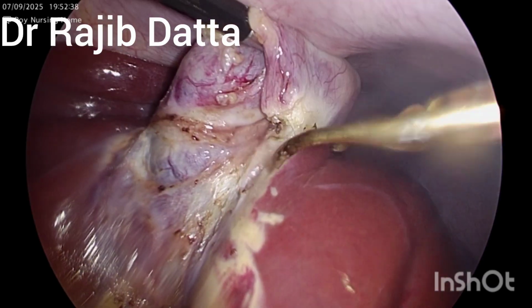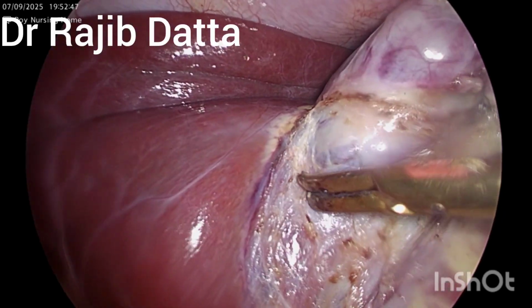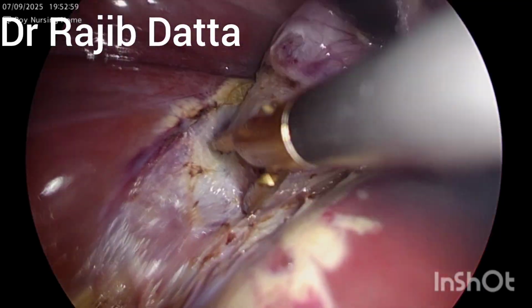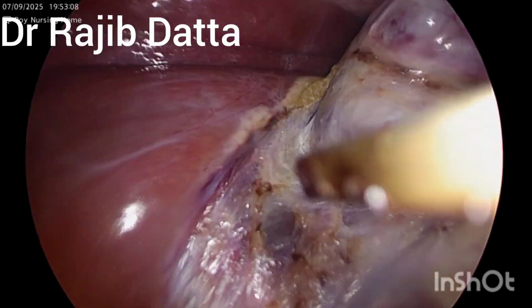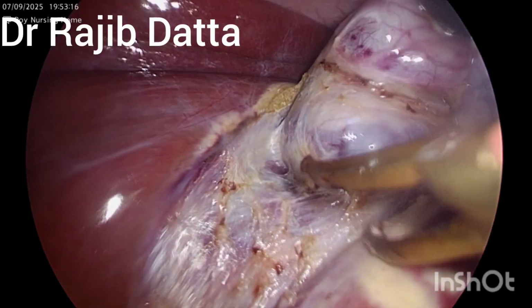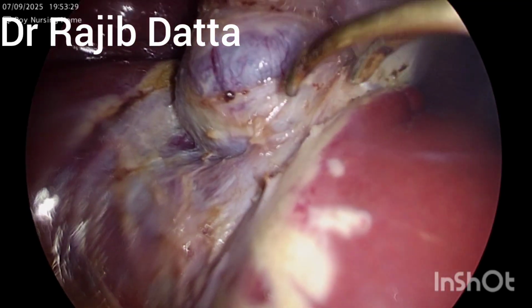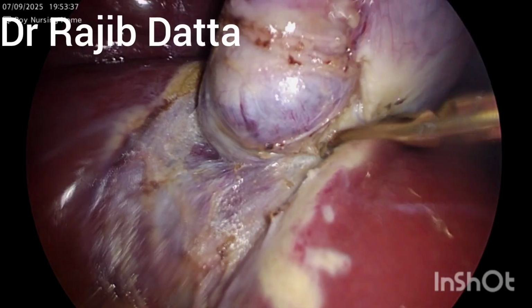And small bites and sticking to this embryological plane will help to maintain the hemostasis, always changing the traction and counter traction during this separation. Don't pull the gallbladder too much, sometimes it may tear off from the liver bed and inadvertent bleeding may happen. So small bites is the main thing here.